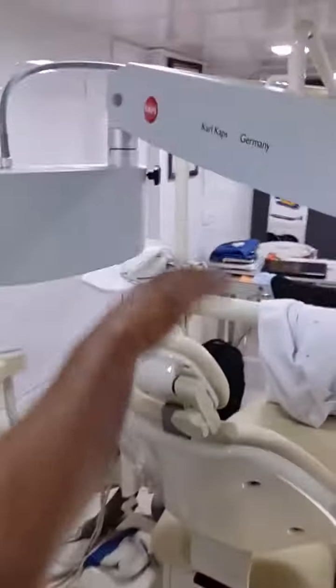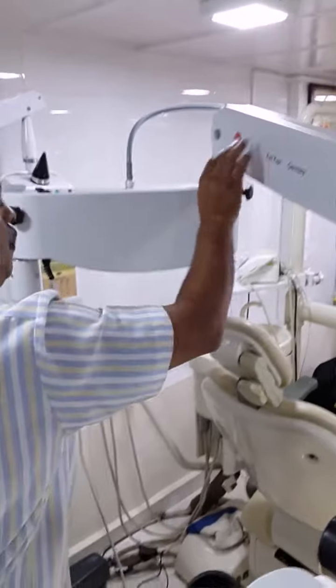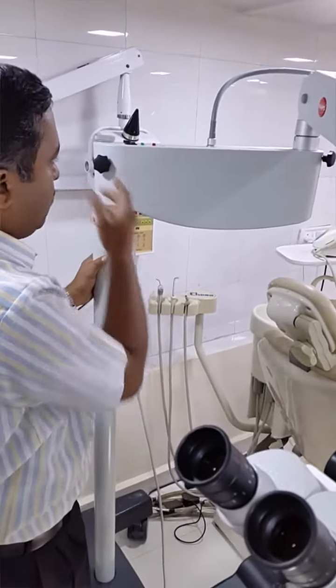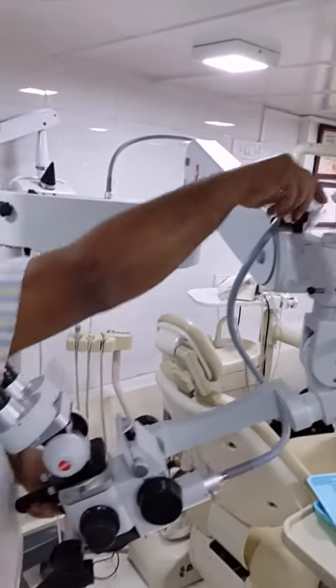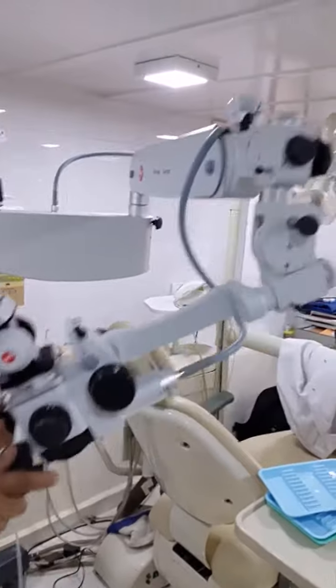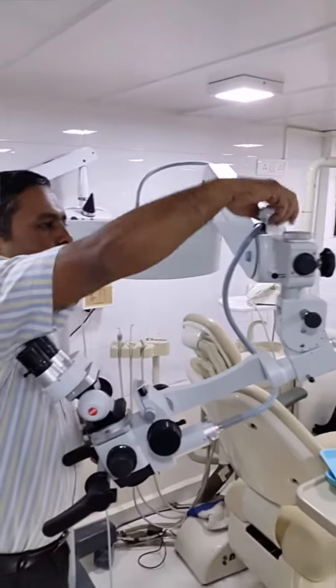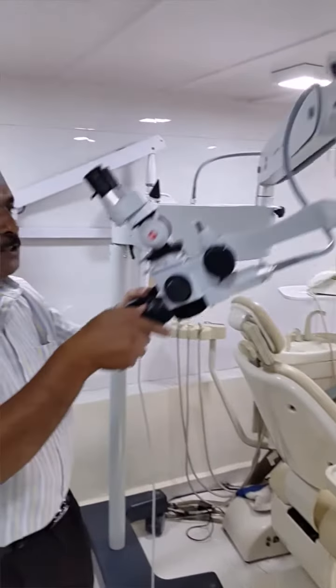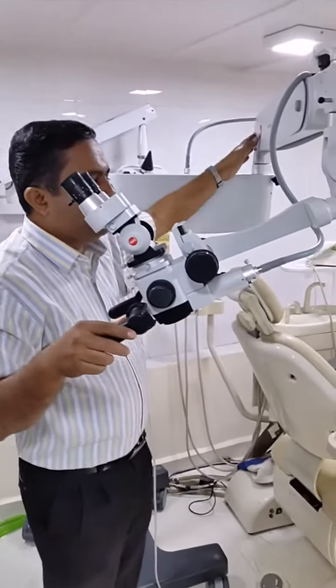Moving to the arm movements — this lock is between the suspension and the arm, and this lock is between this arm and the arm movement. This is the suspension arm which moves up and down. Here is a knob where we can lock this position whenever we want.